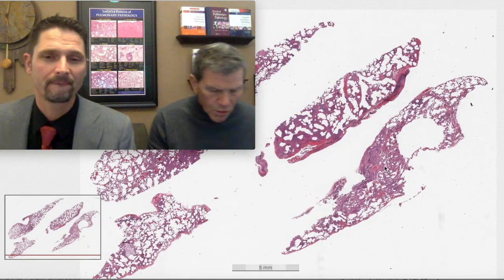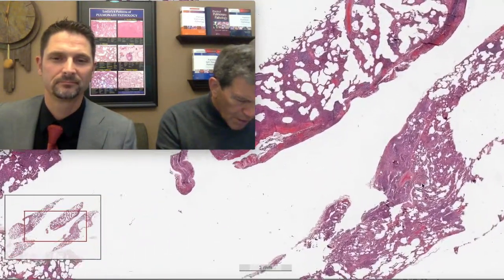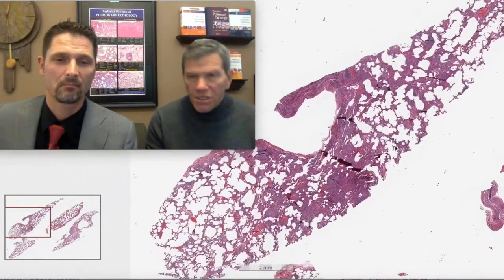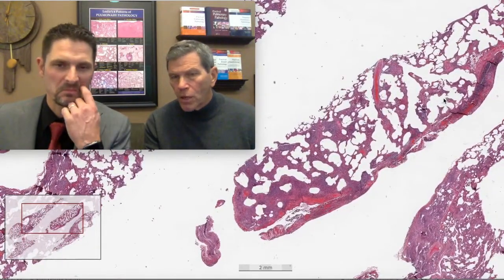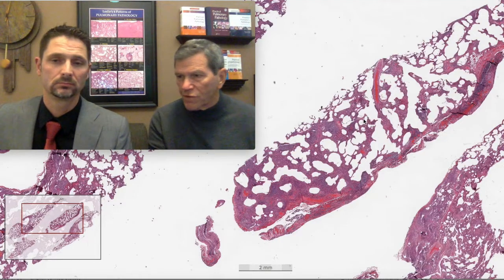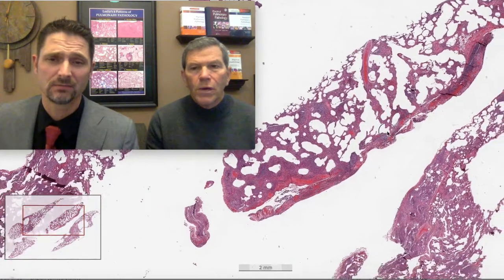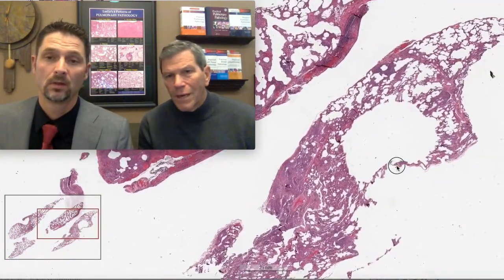Yeah, beautiful. So this is a young woman, a 31-year-old woman, who presents with shortness of breath. She's got a cough, and she's also got malaise. They don't say how long it's been going on, but they say she's definitely got interstitial lung disease on imaging. Okay. Ground glass infiltrates, presumably. We don't know how much traction bronchiectasis or fibrosis. We just know that it's interstitial infiltrates, right? Right. So a VATS biopsy is done, and here's the VATS biopsy.